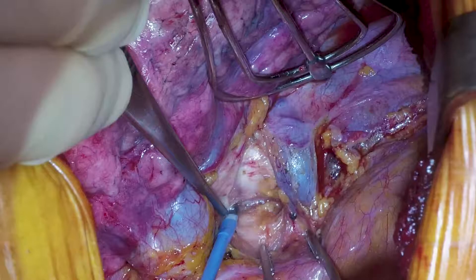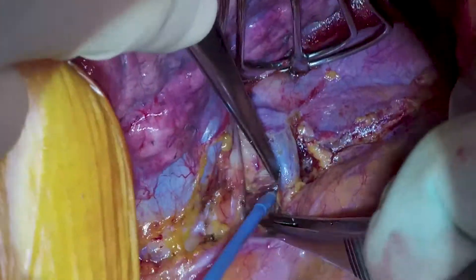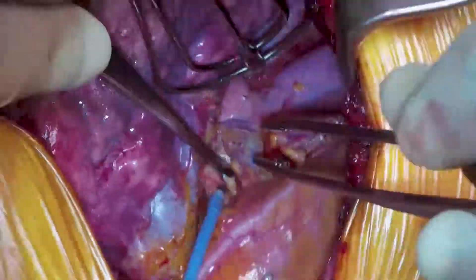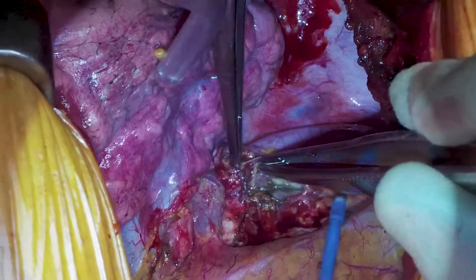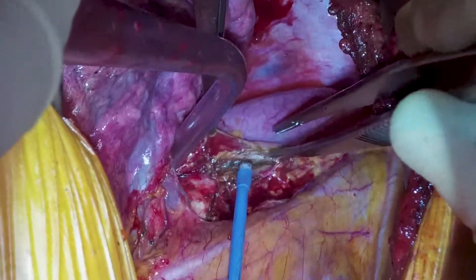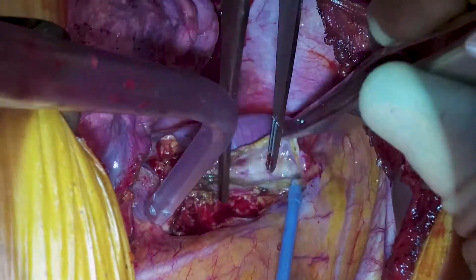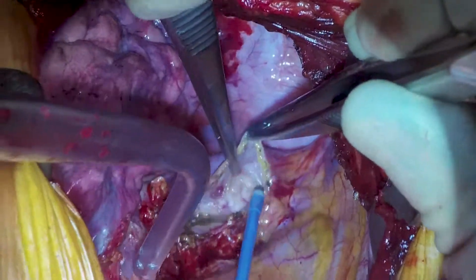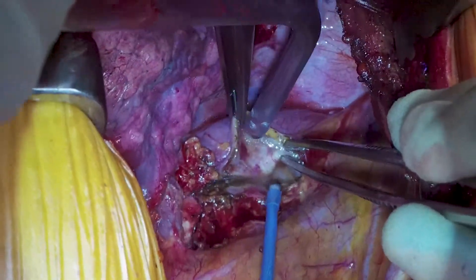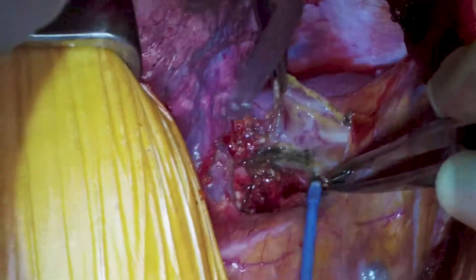We've moved the right upper lobe posteriorly using an Allison retractor to work near the azygous vein, which is tracking backwards, and we're starting to take out the lymph nodes. You can also see the right main bronchus. We'll move above the azygous and start working out the lymph nodes, lifting up the pleura, going along the azygous, finding the vagus, and sticking anterior to that to dissect the lymph nodes out.